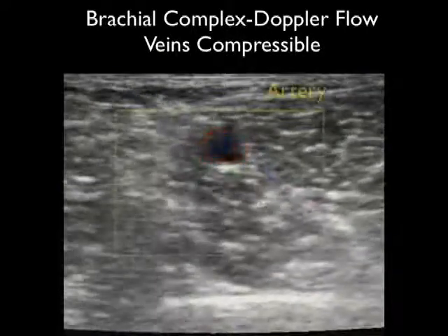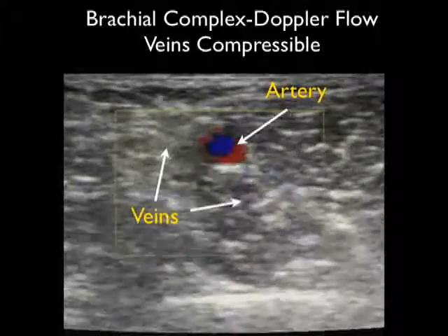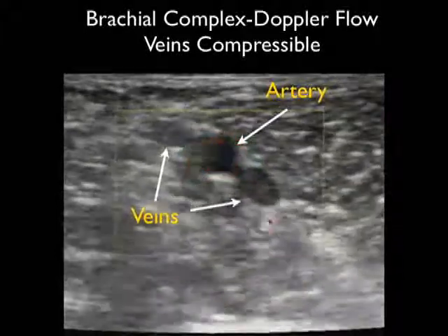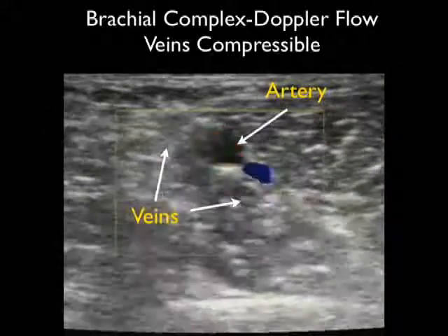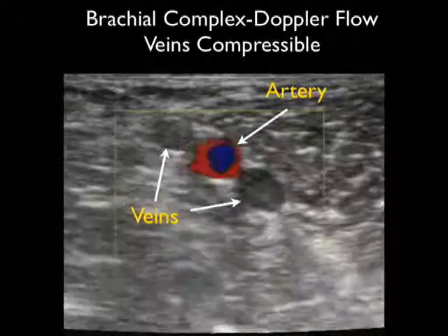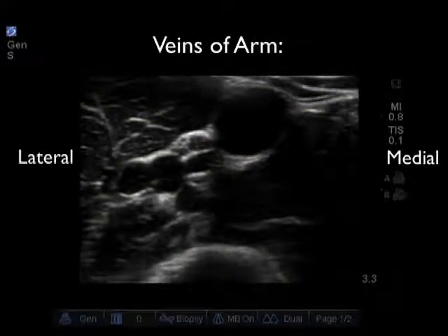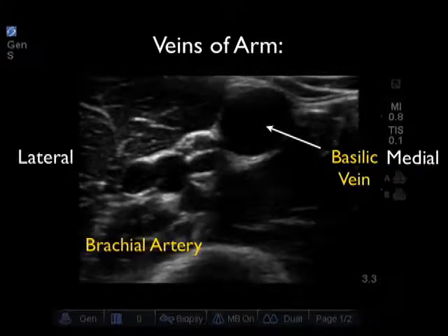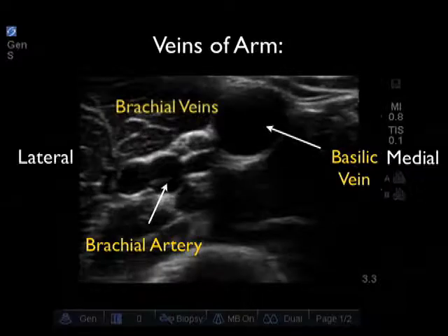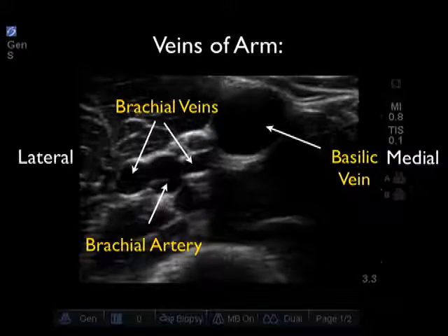Putting it all together — using Doppler flow and applying compression — the brachial artery in the center stays open and has brisk arterial pulsations, while the two flanking deep brachial veins compress completely and show a lack of vascular flow with Doppler interrogation. Now let's look at a video clip showing all of the veins of the upper arm in relation to one another. Medial is to the right and lateral is to the left. We see the larger and more superficial basilic vein, more medial and superficial to the brachial complex, which is located to the left, with the central brachial artery and two flanking deep brachial veins.